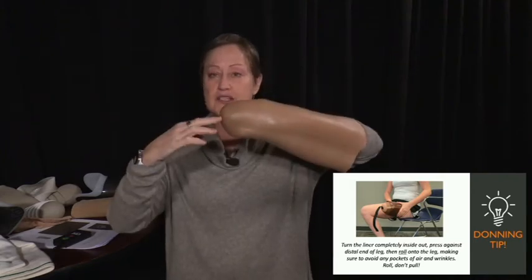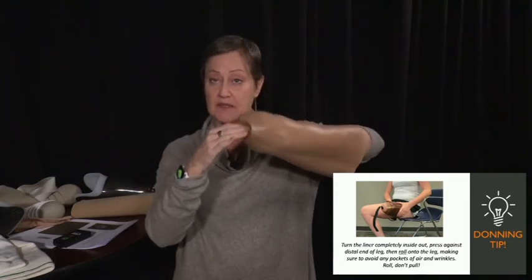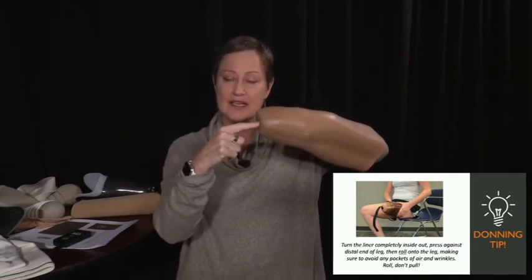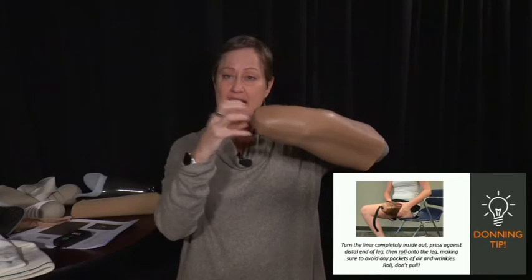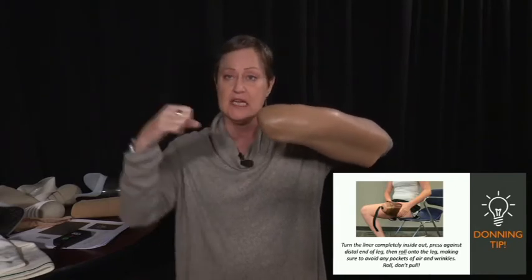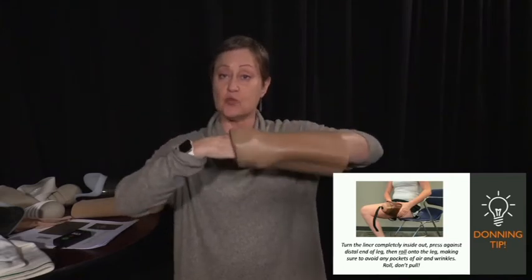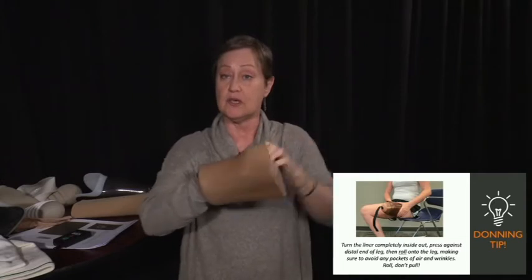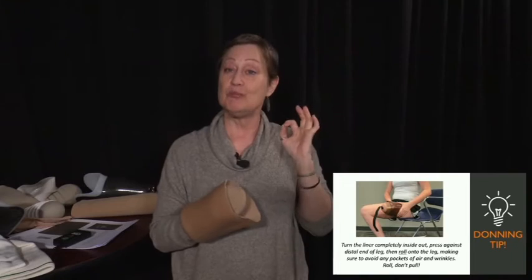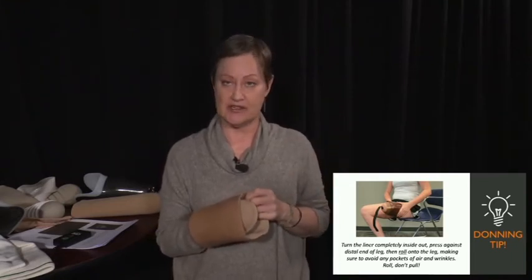And then you want to press the end of the leg into the end of the liner. We really want to avoid a pocket of air. Any pocket of air is going to create some extra pull and you're going to get skin breakdown, no question about that. So it goes flush against the end of the leg and then the liner is rolled onto the limb all the way. Roll, don't pull is the instruction you can give to your patients.